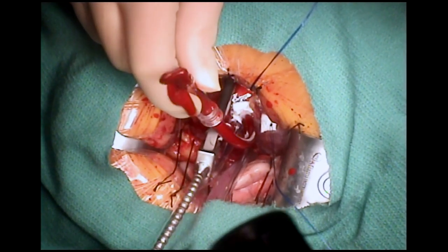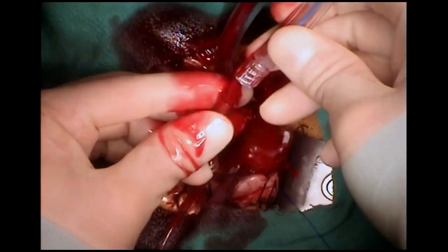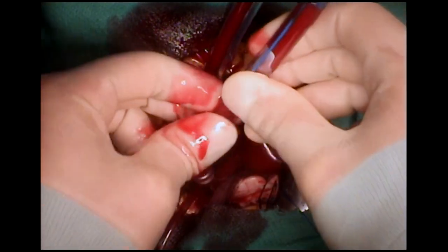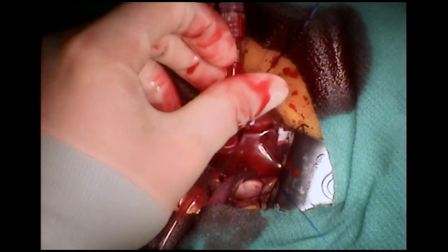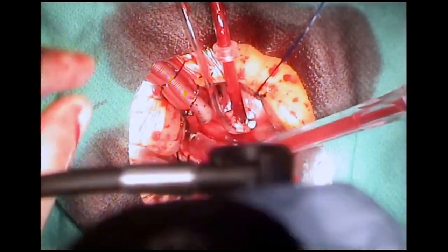The usual de-airing maneuvers are performed and the cross clamp is released. Venting is performed through the aortic root as well as through the left ventricular vent placed via the right superior pulmonary vein.